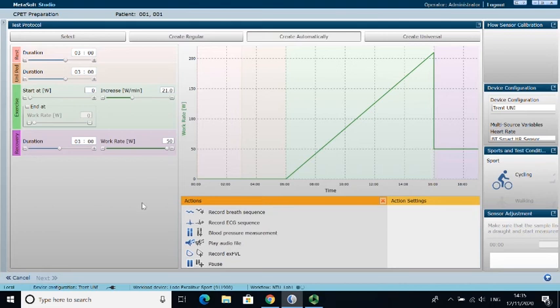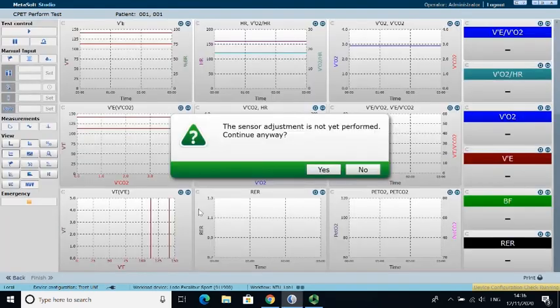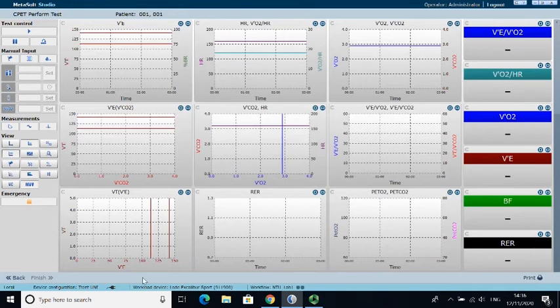So for us, we did this protocol where it's a 3-minute of rest, 3-minute of unloaded cycling, and then we have an exercise ramp which starts at 0 watts and increases indefinitely at a rate which you determine depending on the participant's size, fitness and things like that. And then we click them through into a recovery phase. And then once we're happy with that, presuming that you've already calibrated the machine, which we'll talk about in the labs, then this is the opening screen to collect the data.